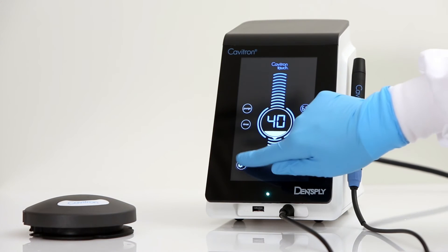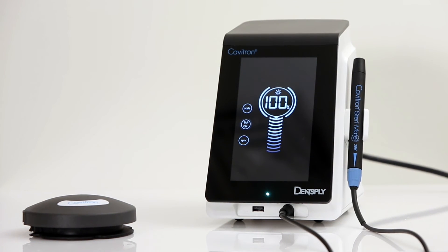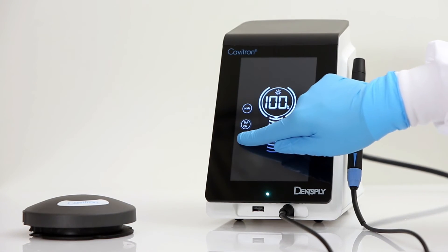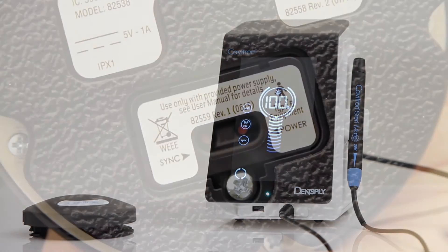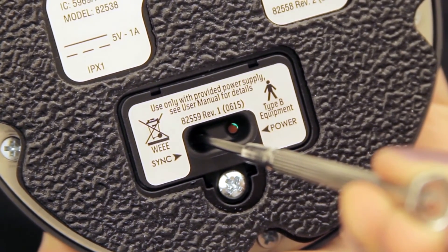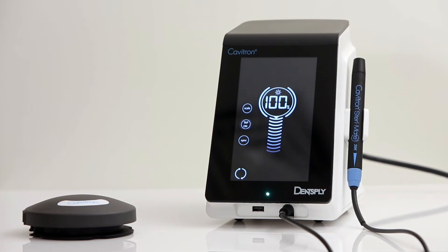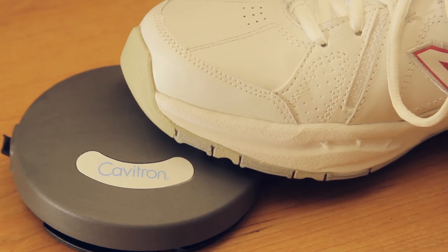Next, press and hold the settings icon until the settings screen appears. Press the sync icon on the settings screen, followed by pressing the red sync button on the bottom of the foot pedal and hold for at least 3 seconds. Synchronizing is complete once the sync icon has stopped rotating and a sound indication occurs. In order to verify proper communication, press the scale icon to return to the main screen. Press the foot pedal to the second position and ensure the boost is activated.